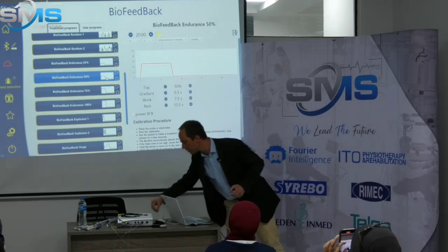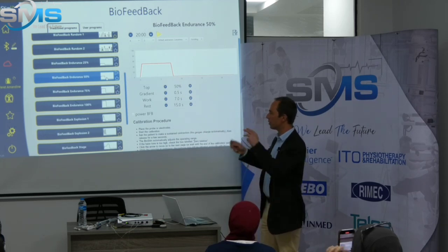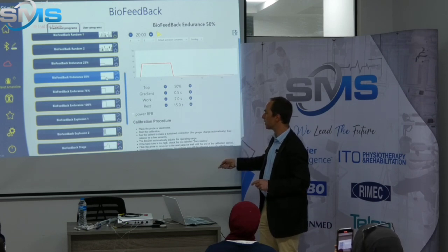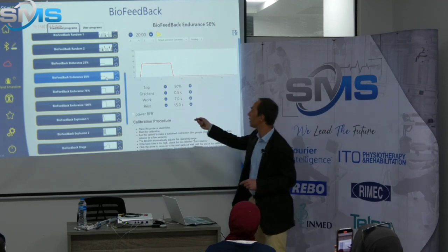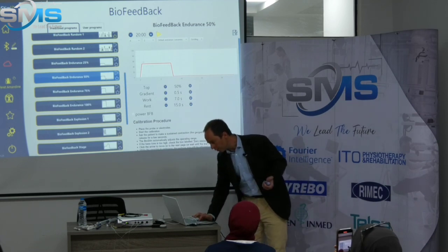You see, we have here different shapes. So here we see a plateau. So that's for slow fibers. Here it's very specific to fast fibers, only peaks. And we have many more difficult ones if your patient's getting better. But usually we start with this one. And at the end, we can have a mix of everything. So if we start, we'll see how it works again.